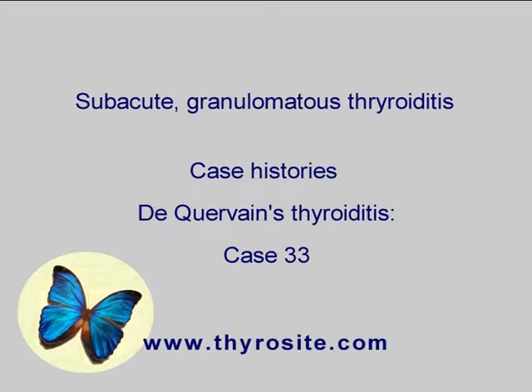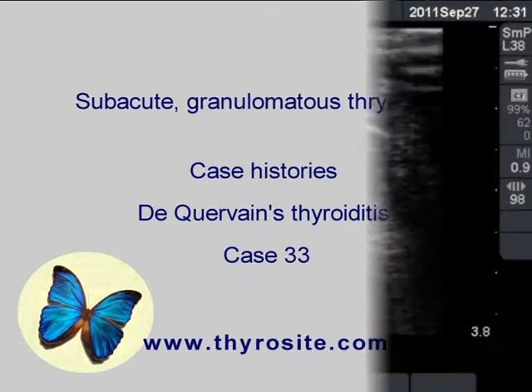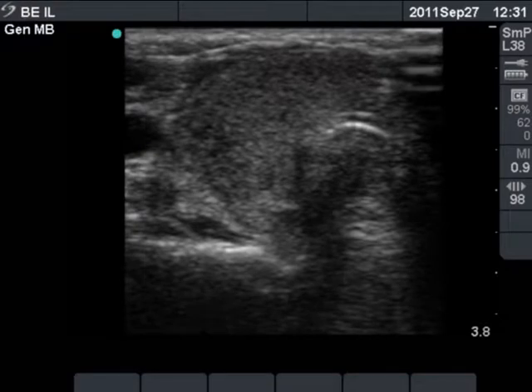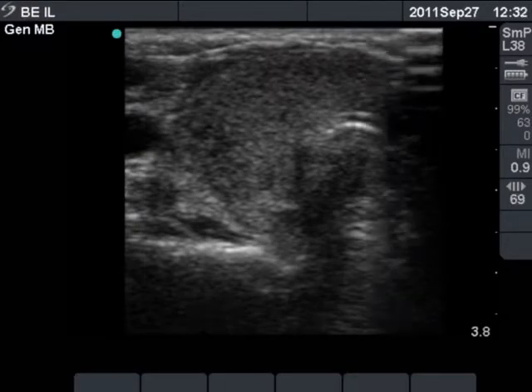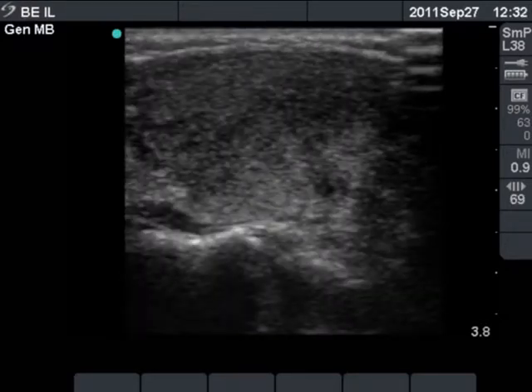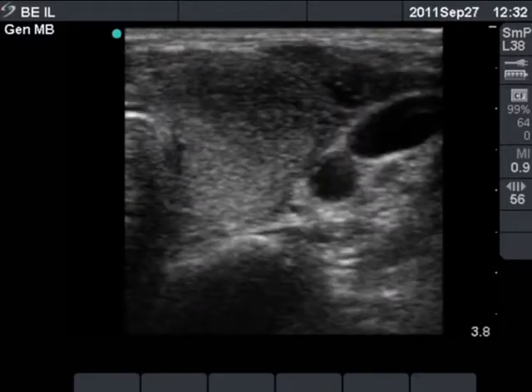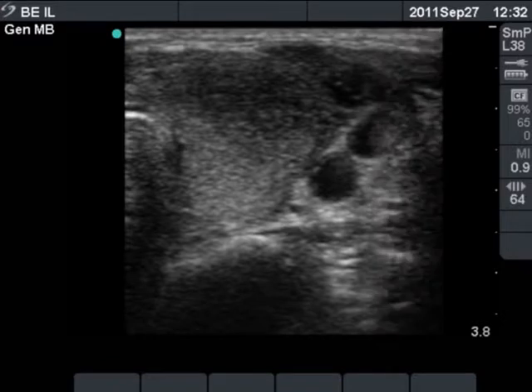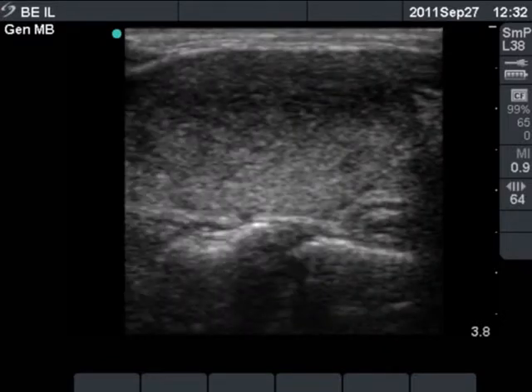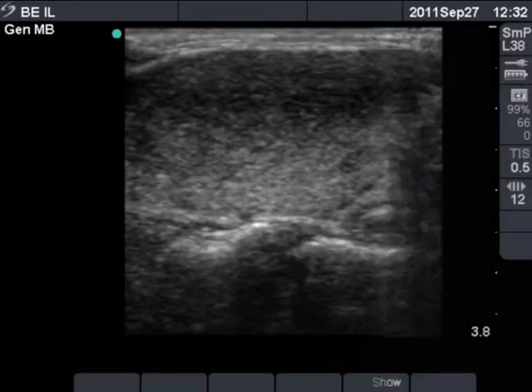A patient is shown with a clinical presentation implying subacute thyroiditis. The thyroid is ecnormal. On the longitudinal view, a larger hypoechoic area is presented. The pattern is more characteristic in the left lobe, with hypoechoic lesions with ill-defined borders and decreased vascularization.